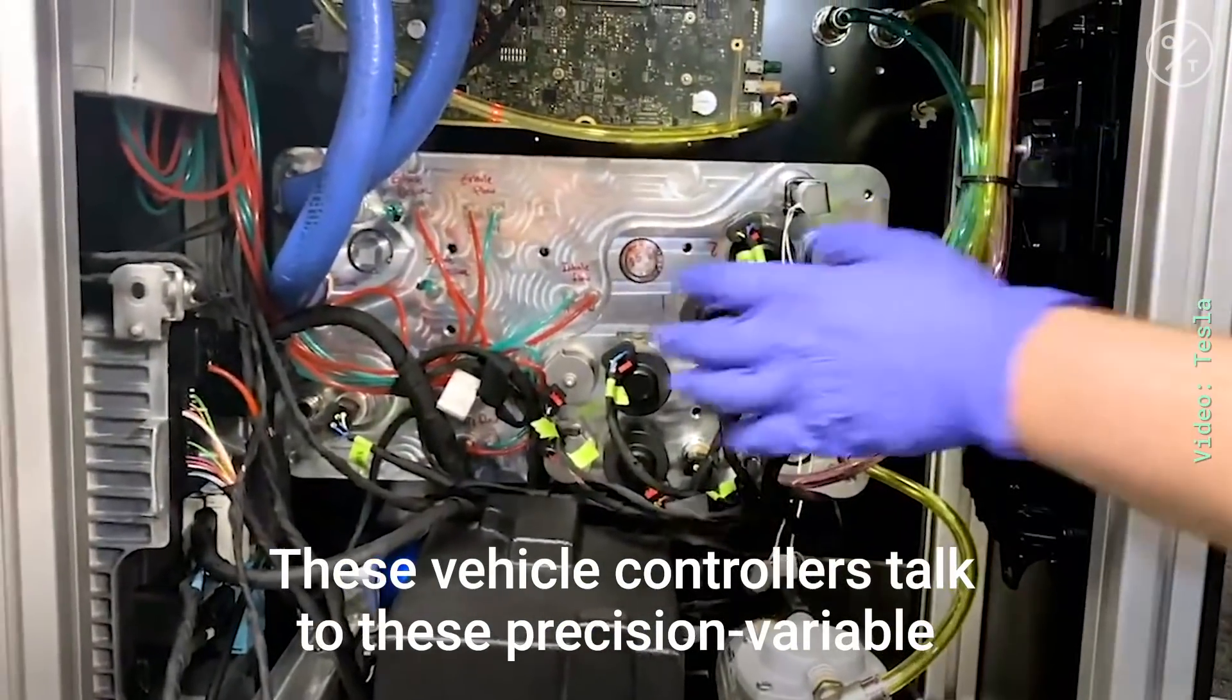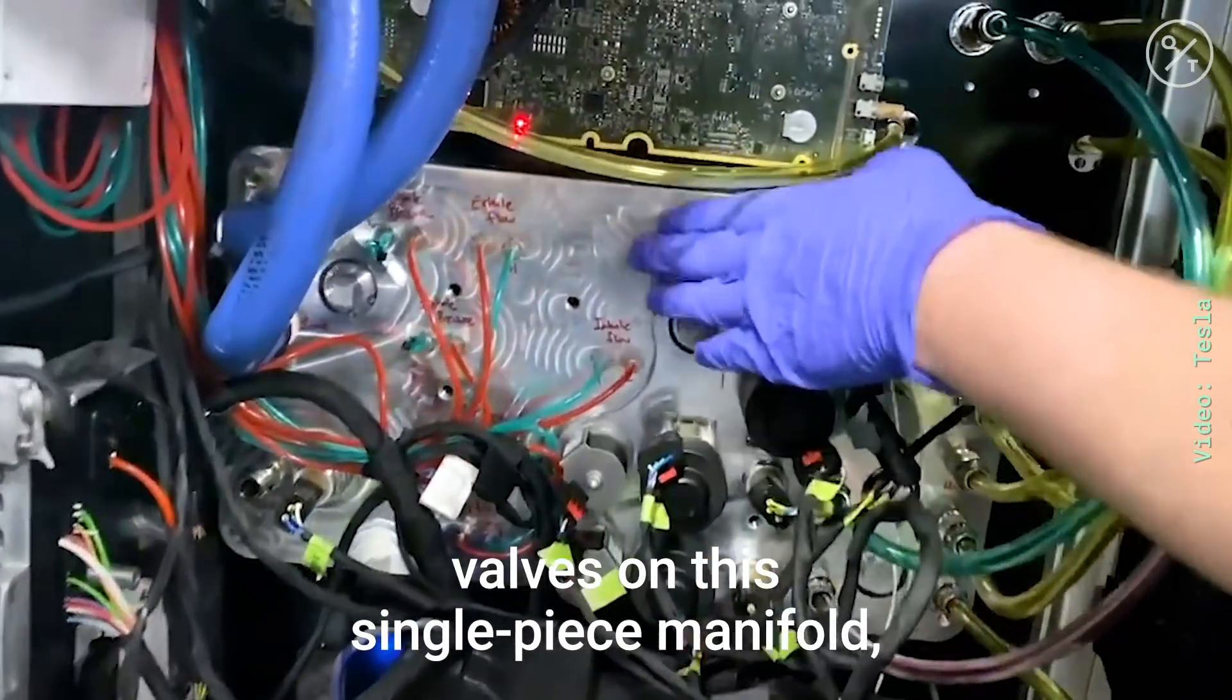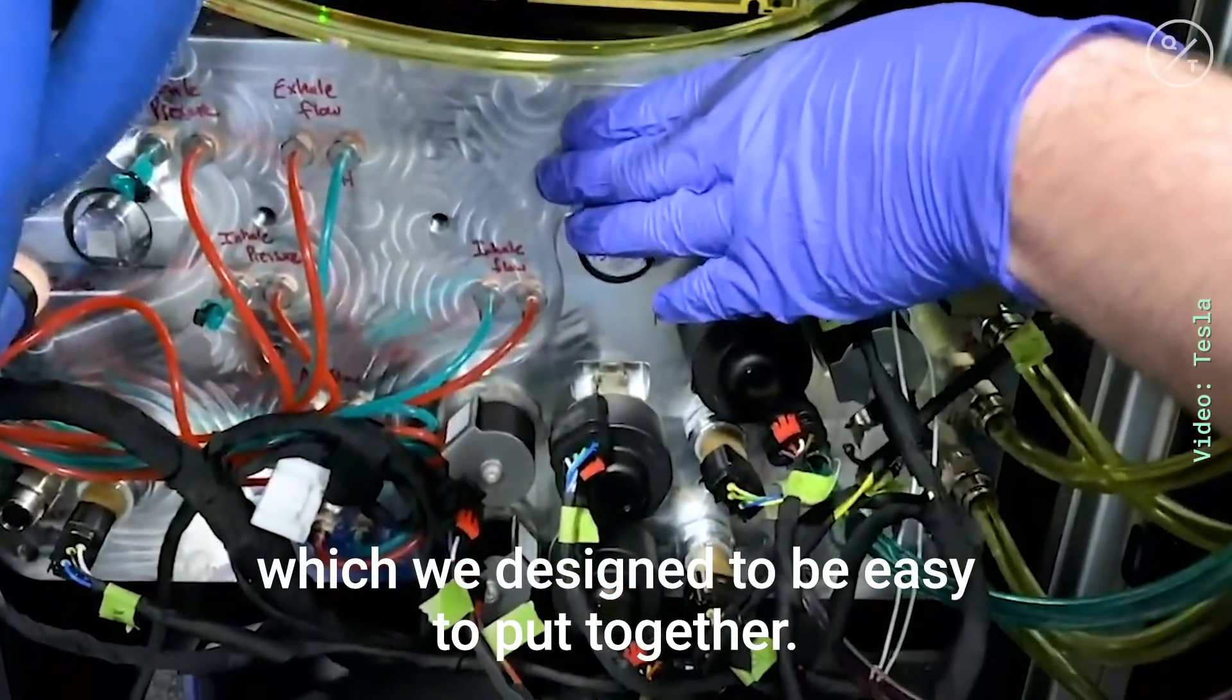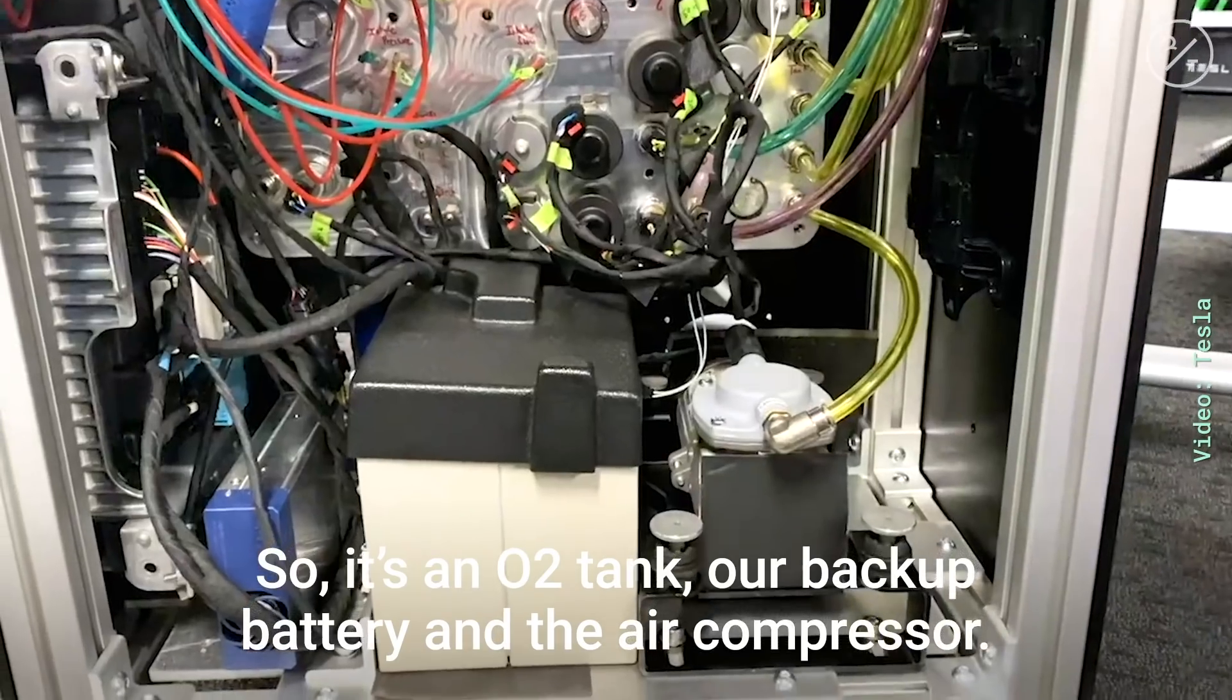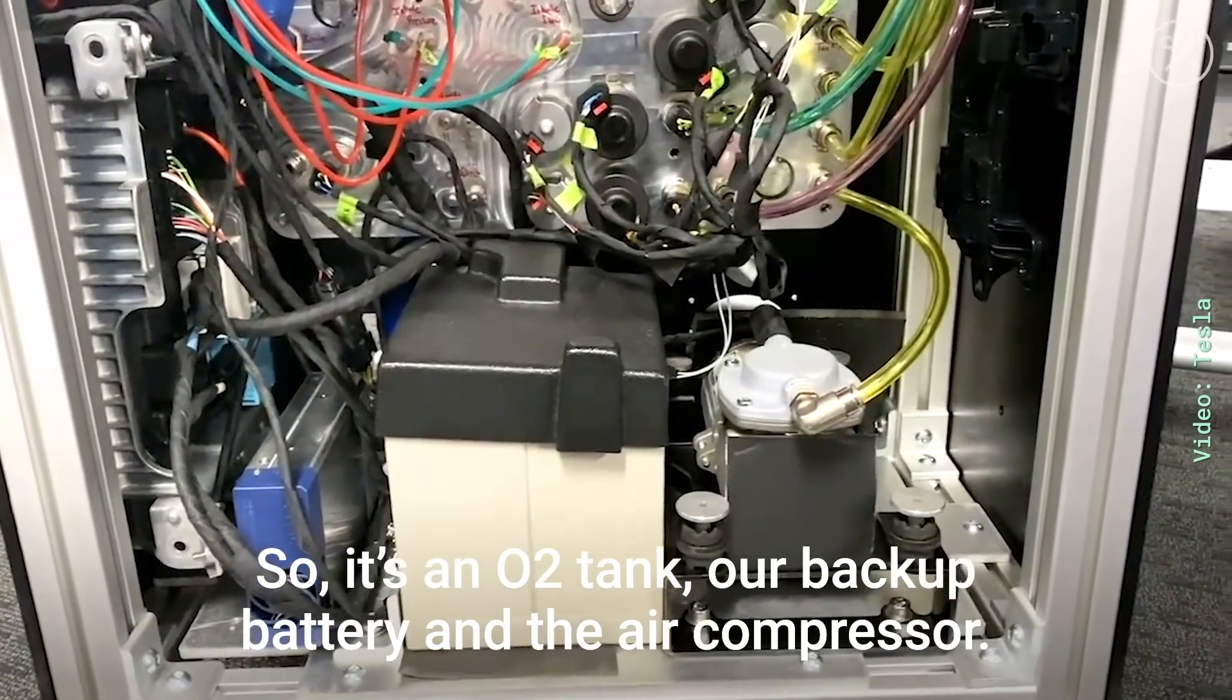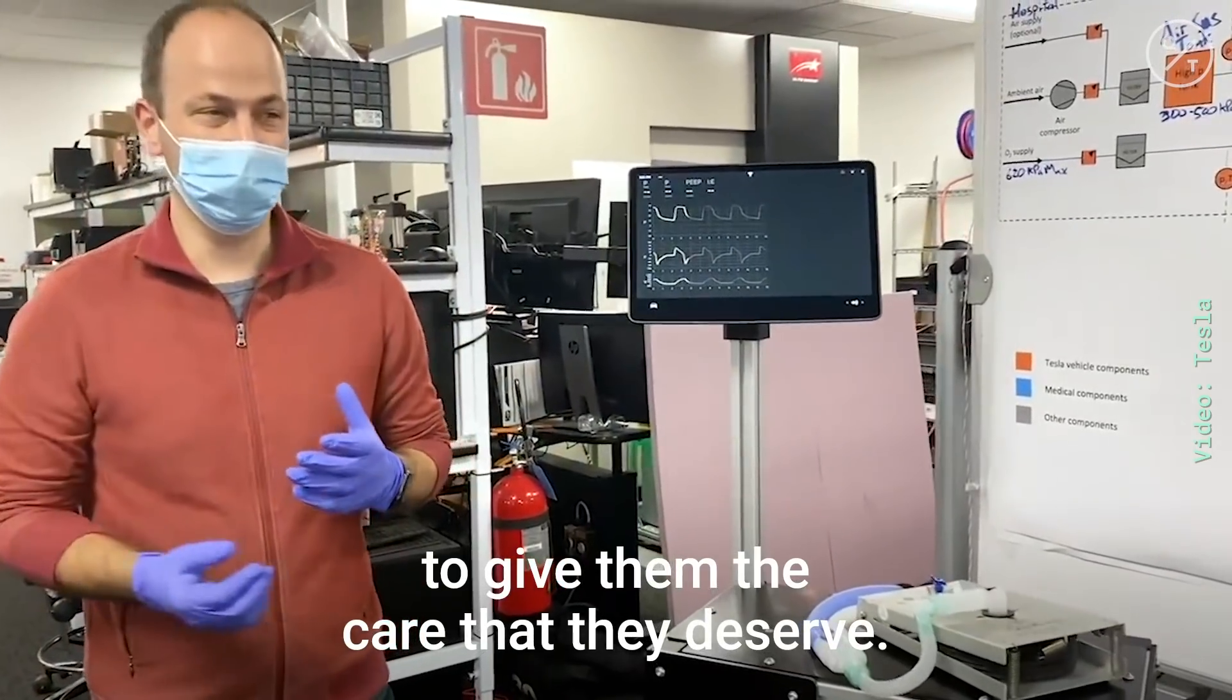These vehicle controllers talk to these precision variable valves on this single piece manifold which we designed to be easy to put together. We also put in on the bottom a backup system. So with an O2 tank, our backup battery and the air compressor, you get 20 to 40 minutes to move that patient where you need to give them the care that they deserve.